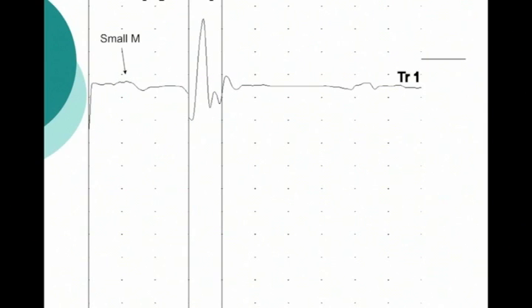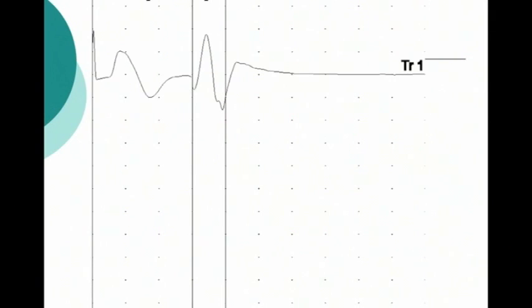Unlike the F wave, the H reflex is best obtained when you don't use that much current, or at least not enough current to get a big M response. And here you either have a small m or no m, and you have a huge H. Those are the ideal recordings to measure the H reflex and to identify the H reflex from. It's a great response.